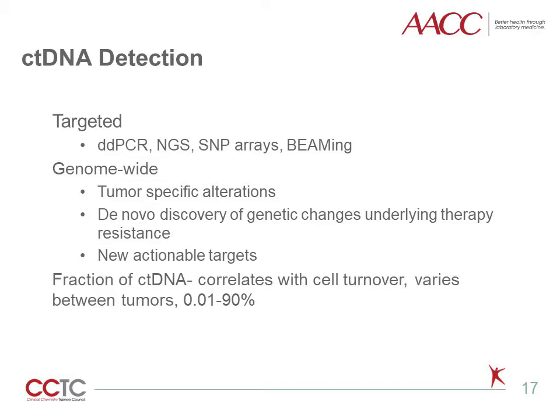Assays used for detection of circulating tumor DNA depend on the underlying molecular alteration being tested. Some commonly used assays include comparative genomic hybridization, SNP arrays for copy number changes, next-generation sequencing that can detect multiple alterations, digital droplet PCR, and BEAMing (beads, emulsification, amplification, and magnetics) to target specific genetic alterations.